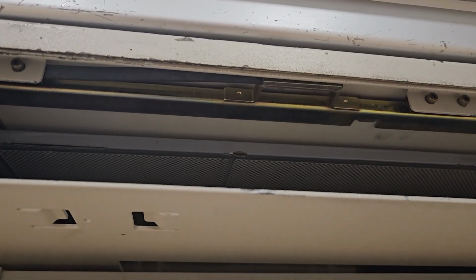The plate has to be placed under the table and the ribs are quite far away and cast an inaccurate shadow. However, there is a solution that is also built into the table for this. A scattered beam grid is built into the table under which the digital X-ray film is first placed.